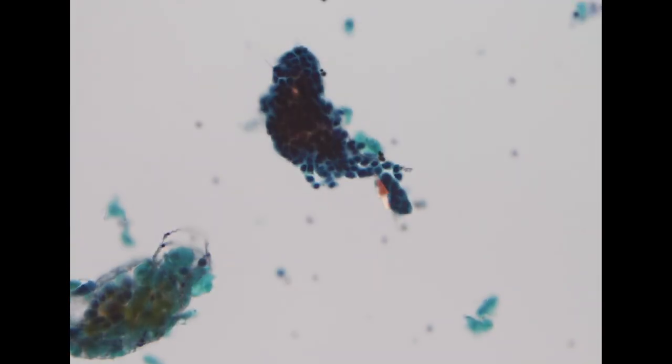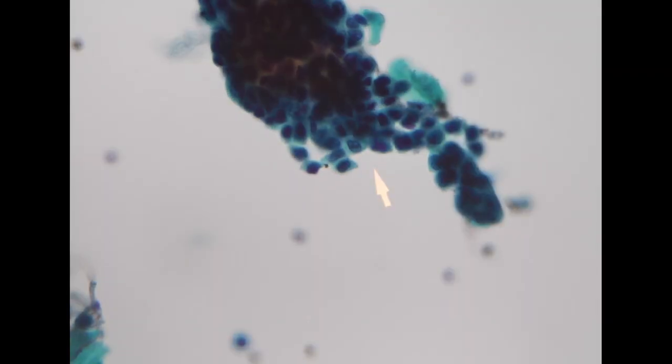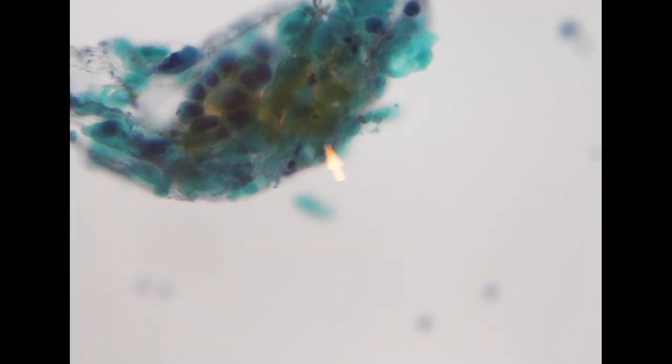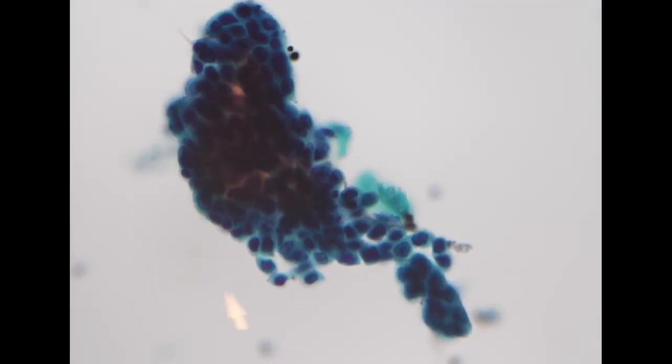When we want to diagnose squamous cell carcinoma, we want to see cells with unequivocal hyperchromasia, as well as high NC ratio and coarse chromatin pattern. So for this case, I think this is necrotic keratinized cells, and this is a more basal, parabasal type of cancer cell. So the specimen is diagnostic for squamous cell carcinoma. So it is compatible with metastatic oropharyngeal cancer to the spine.